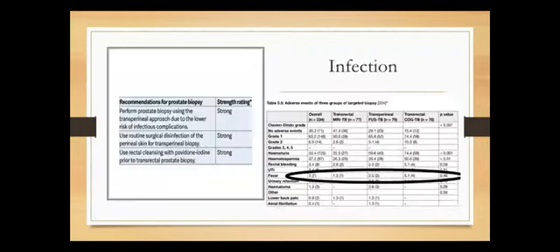So with regard to infection, the EAU guidelines recommend that we should perform a prostate biopsy using the transperineal approach due to lower risks of infection.